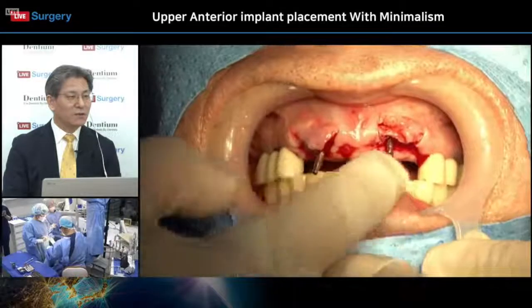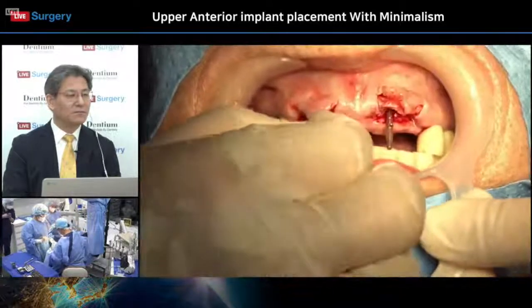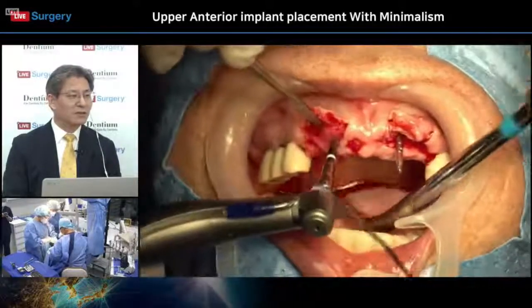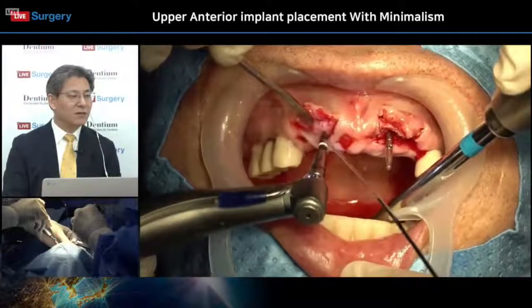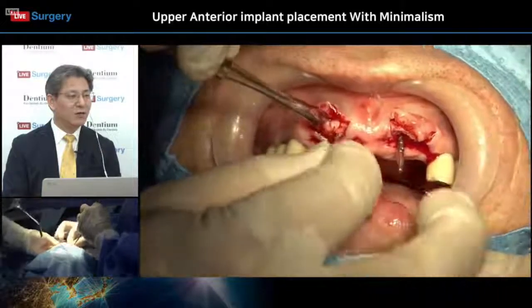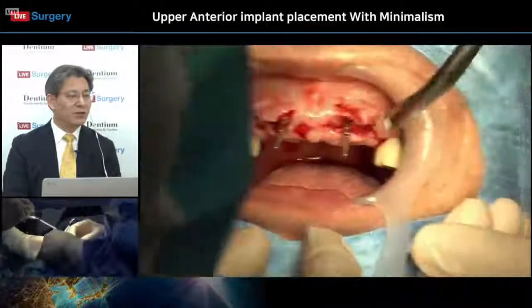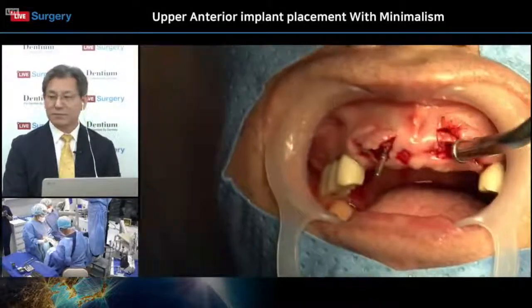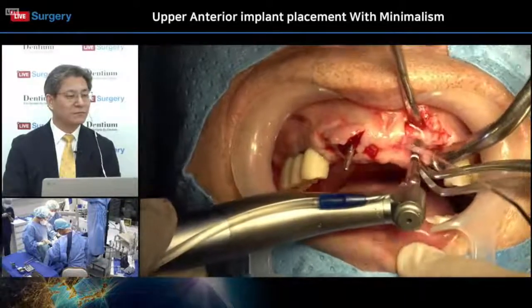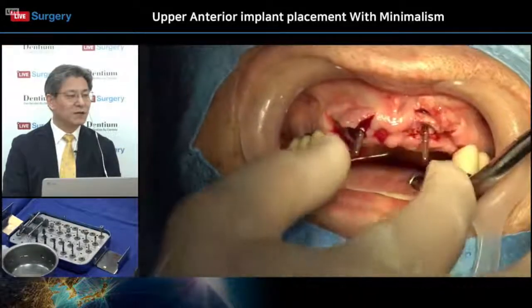We'll try to adjust the angulation a little bit digitally. He wants to adjust angulation. Also this time, using the Lindemann drill is very useful and powerful for making the osteotomy site when we have implantation. So checking again. Almost done. The parallelism is very good. Very nice.